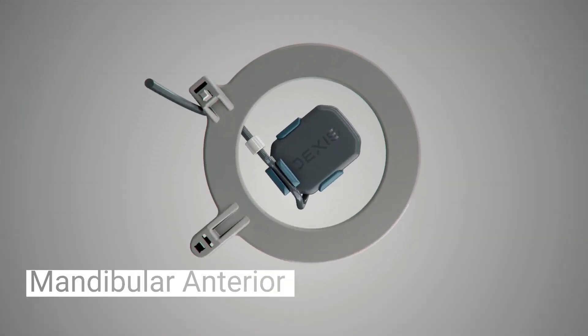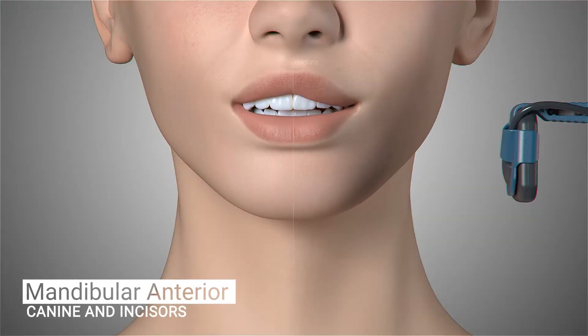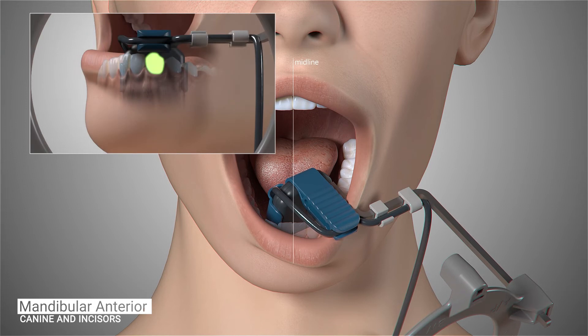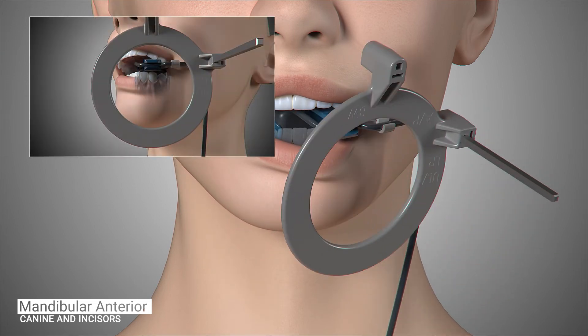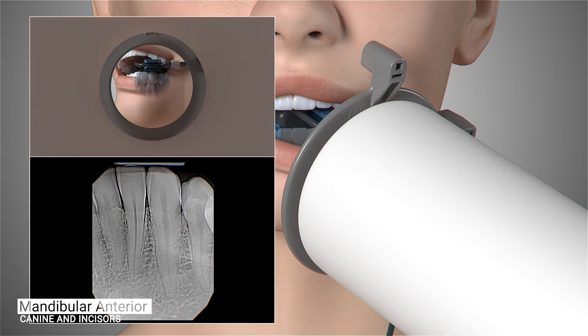The configuration of the sensor and holder does not have to be adjusted for the next set of images, which will be the mandibular anterior canine and incisors. Position the sensor so the canine is centered on the sensor and the sensor is parallel to the long axis of the tooth as much as possible. The tongue should be mildly displaced so the sensor can be inserted into the floor of the mouth and far enough away from the teeth as not to impinge on the mandibular curve. Ask the patient to gently close and slide the aiming ring as close to the patient's chin as possible. The cone of the x-ray emitter must be placed flush with the aiming ring and then trigger the exposure.